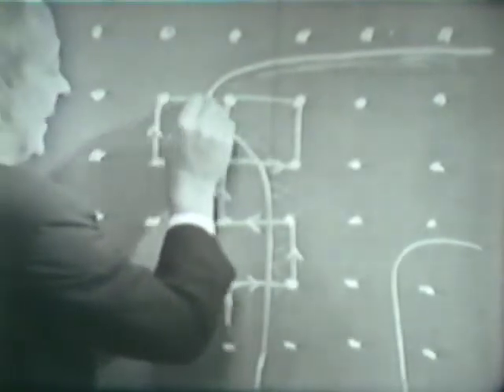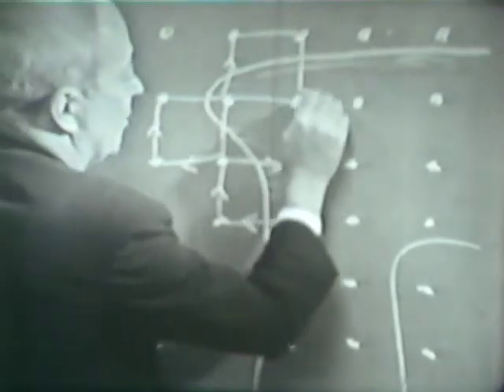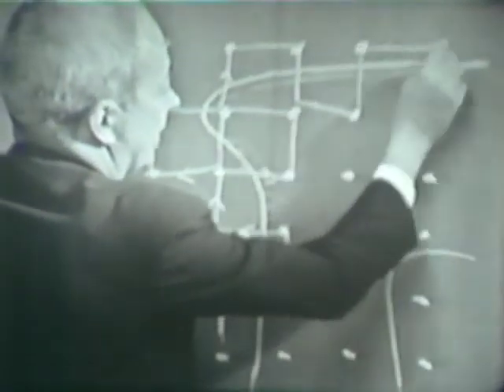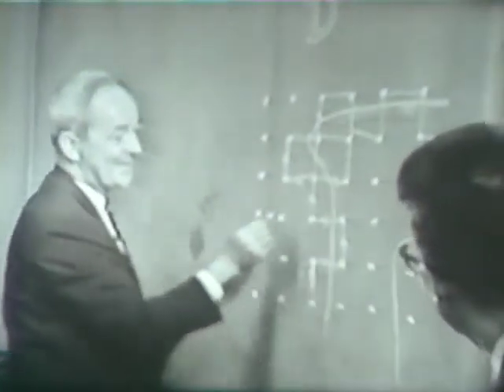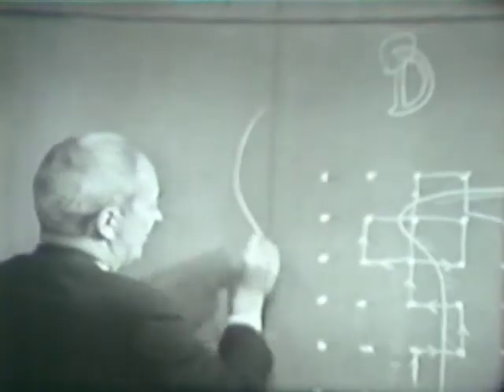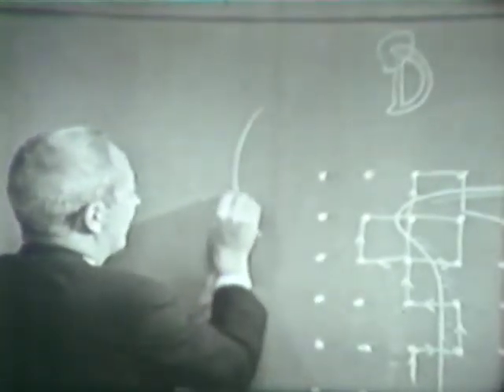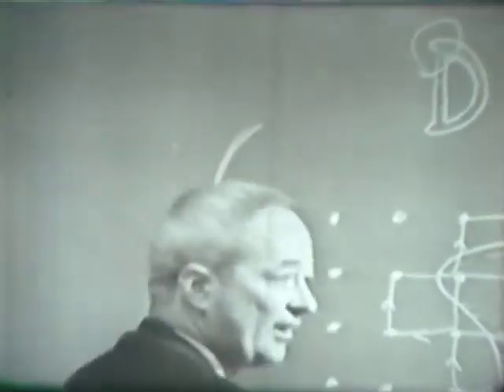Now, as you can see from this expanded picture, it looks a little bit like garbage, but remember that here's the edge of a letter. We really have these spots very close together, so the thing is walking around here and really drawing us a pretty good picture of the edge of the letter.